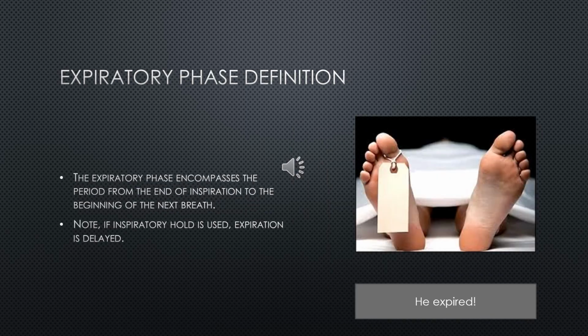All right, the expiratory phase definition, not when the patient dies, but the expiratory phase encompasses the period from the end of inspiration. So there's inspiration and then there's a pause, typically, and then it goes into exhalation. So from that end of inhalation on to the next breath.